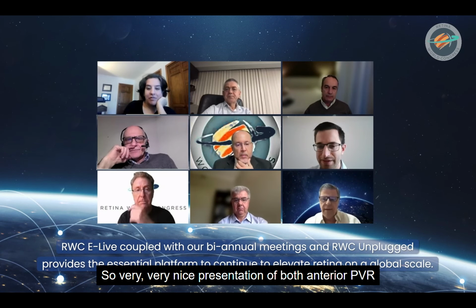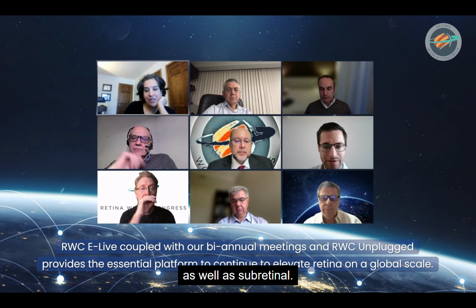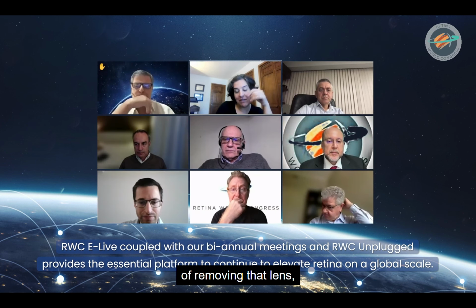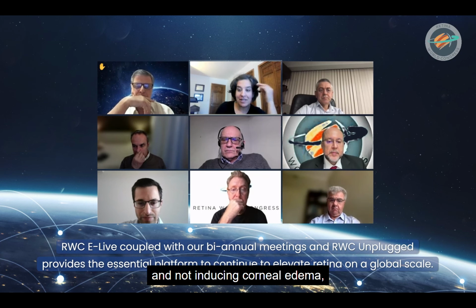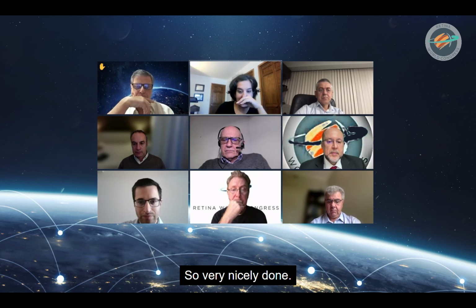So, very, very nice presentation of both anterior PVR as well as subretinal. A couple of comments. So one, you did a beautiful job of removing that lens, because sometimes the challenge is removing that lens and not inducing corneal edema, which now affects your visualization, which was the goal in the first place. So very nicely done.